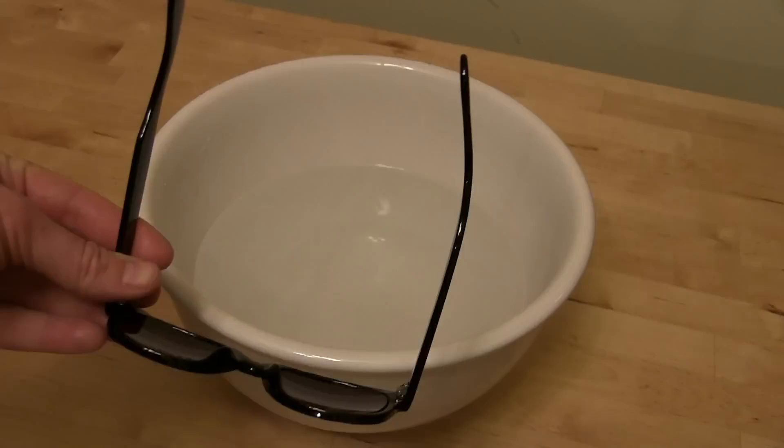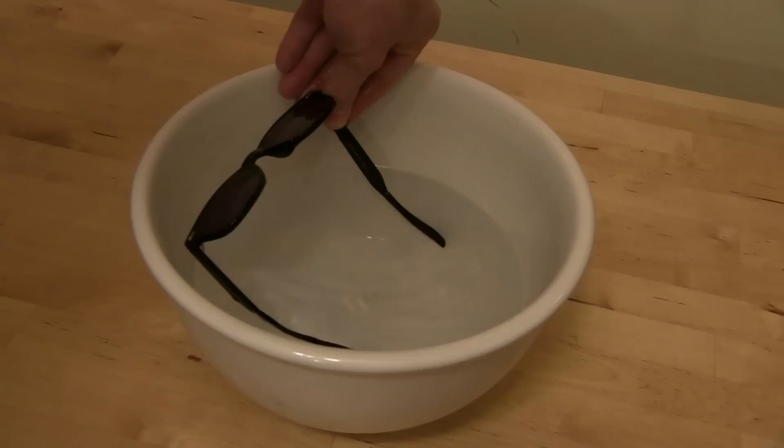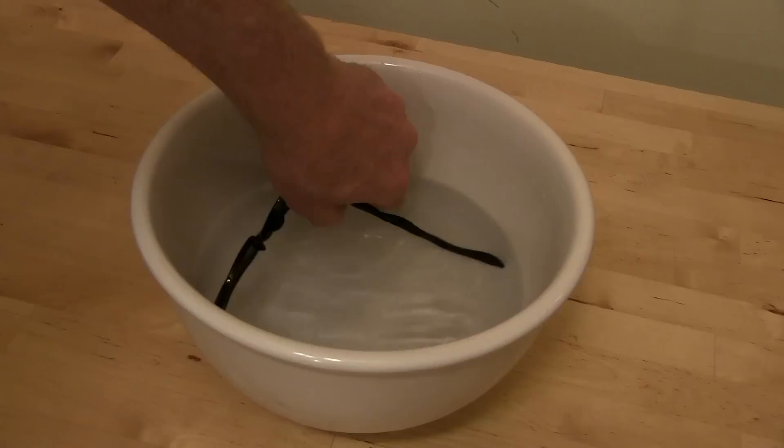What you want to do is get some water that's hot like a nice warm bath, but not hot enough to burn you, and then soak the part of the glasses that you want to bend. In my case I'm going to do the arms, and just soak it in there for 30 seconds.